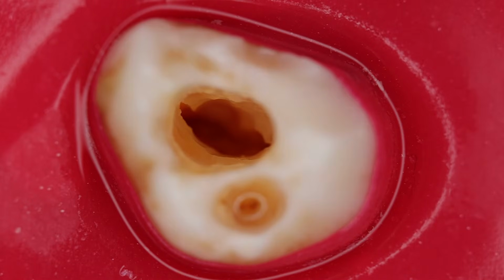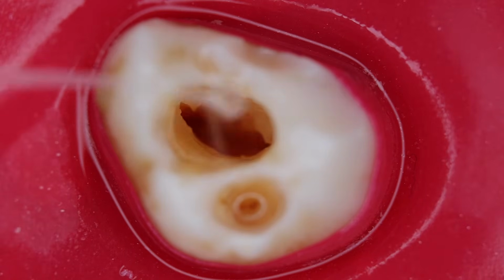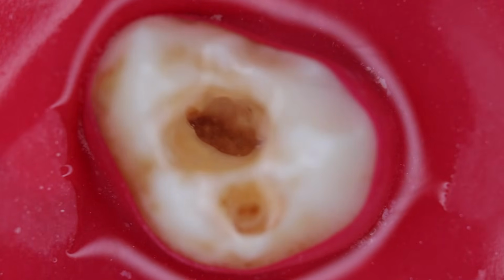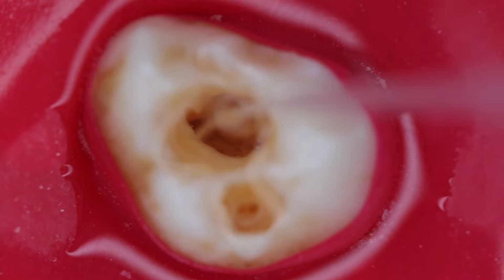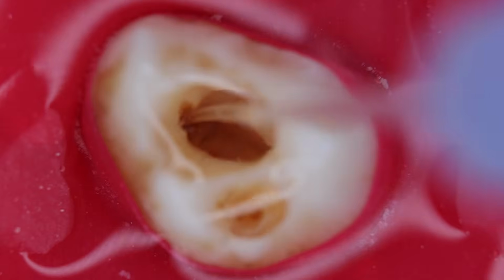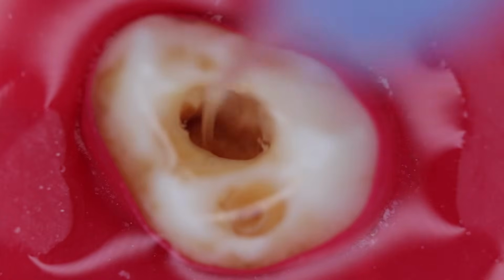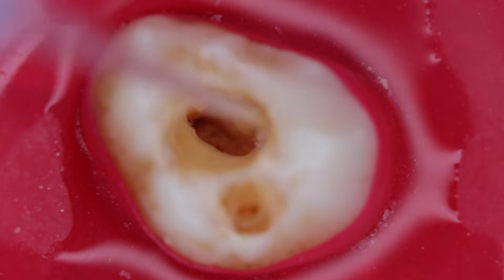Now once you have inserted the files into the canal, this is the time you should always use an endodontic irrigation protocol with a side vent needle. So this is a side vent needle. The first irrigant that you can start with is sodium hypochlorite. And why? Because you need time with the sodium hypochlorite to dissolve the necrotic pulp tissue that is there, as we have inserted the file.